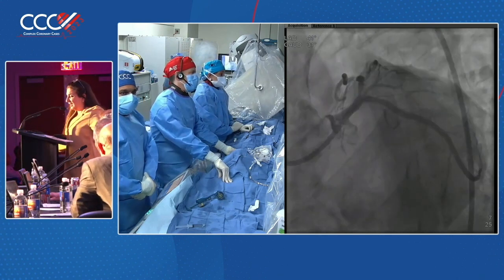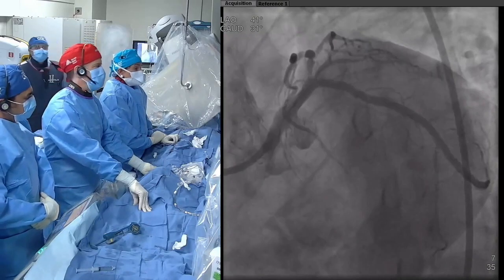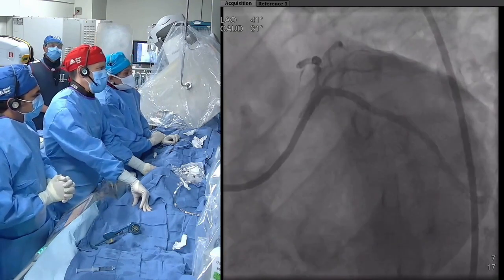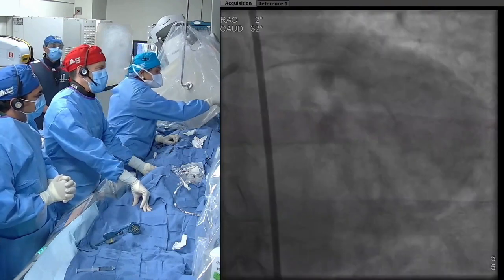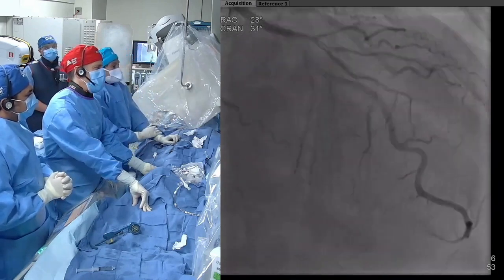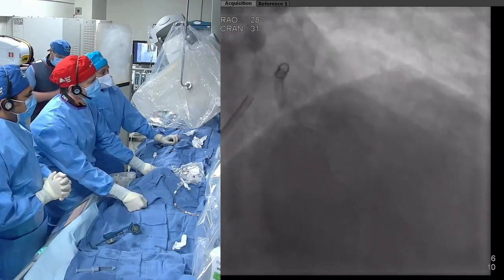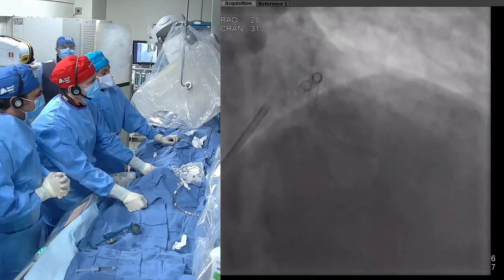All right. Dr. Kinney, tell us how you're going to do this. So with imaging and without imaging, I think without imaging, I'll still nail the ostium, but we have imaging since it has been heavily requested. We will show the IVUS. And going back to the point, everything taken into equation, yes, excellent points that if you see this bifurcation, can we do a provisional stenting? So the ostium of the diag, if you see the angle, the way the diag is taking origin, I would say the disease is still there about 60-70%.